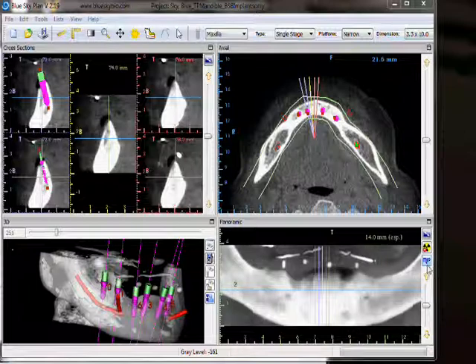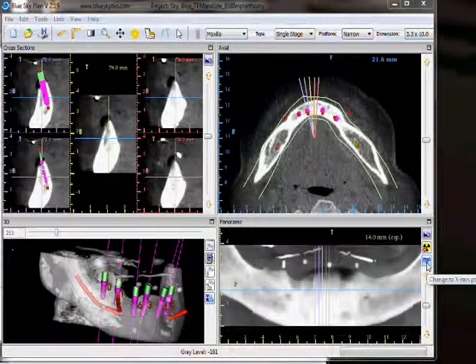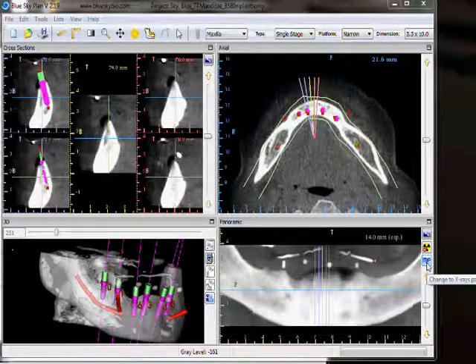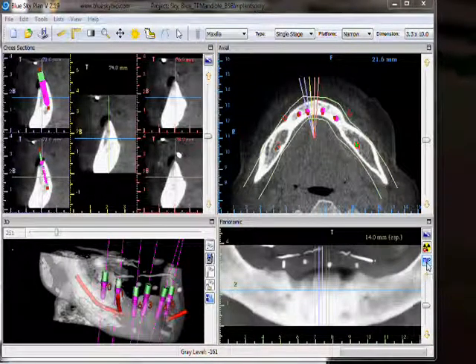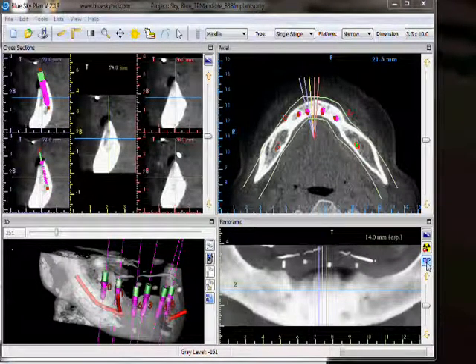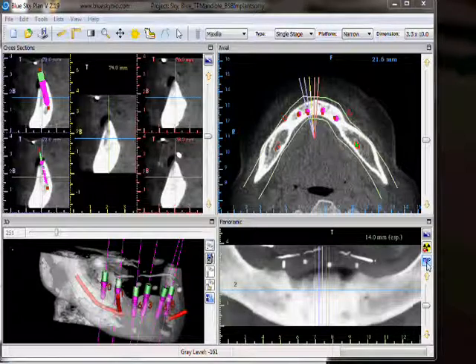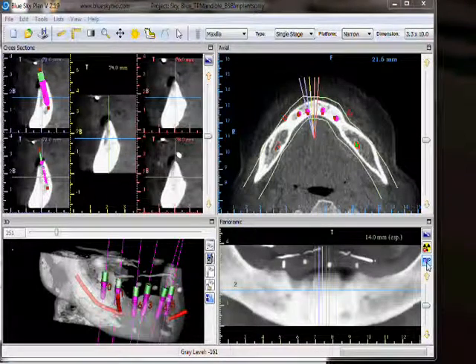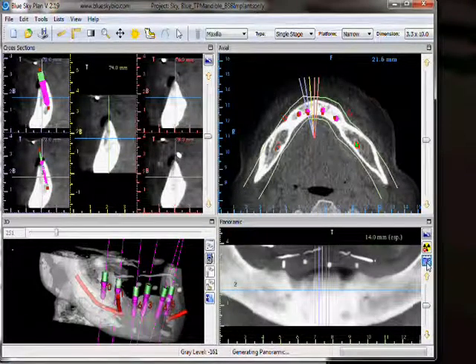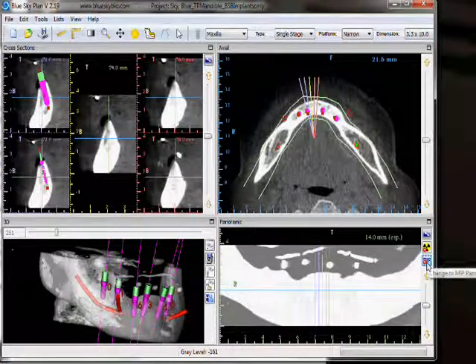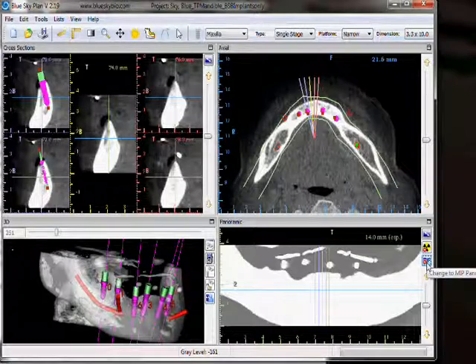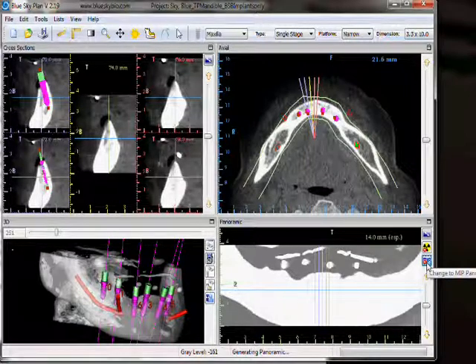Clicking on the third icon, the MIP, shows us our composite image with maximum intensity projection, and you can turn that on and off by clicking once on the icon.